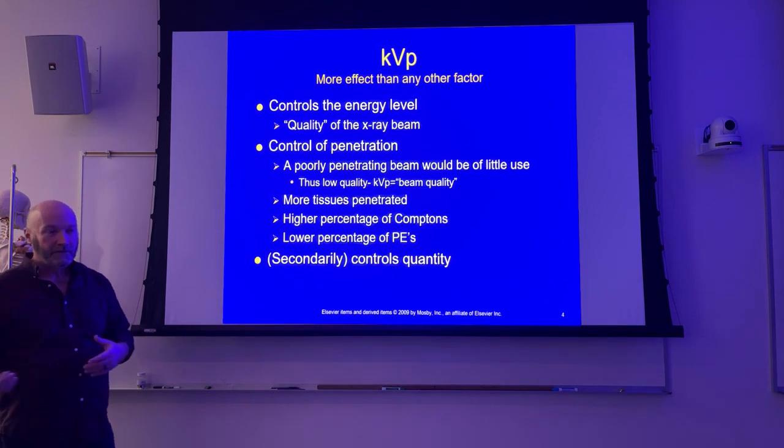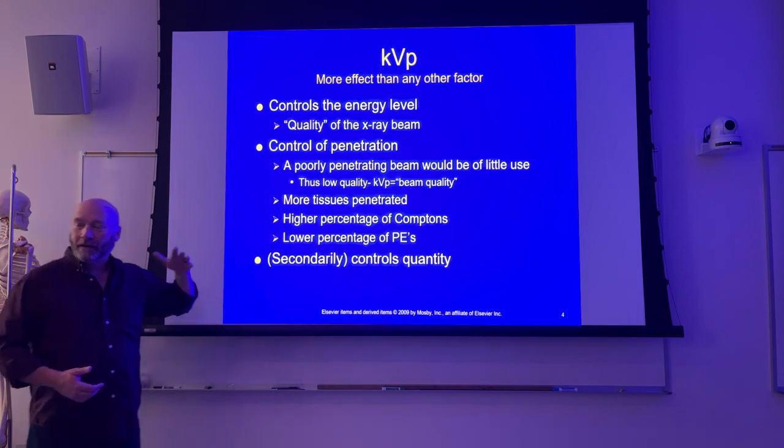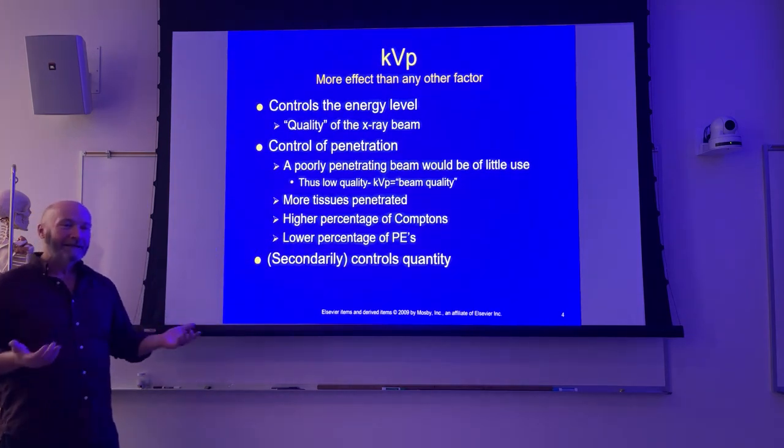So why not change kVp? That's a question I can't really answer from an industry standard. It's just that this is the way we've always done it, right? So I expect that that's going to change, and it has to a degree.